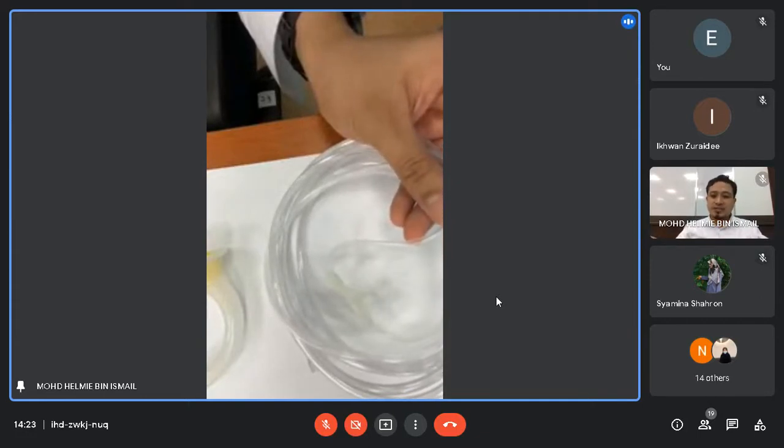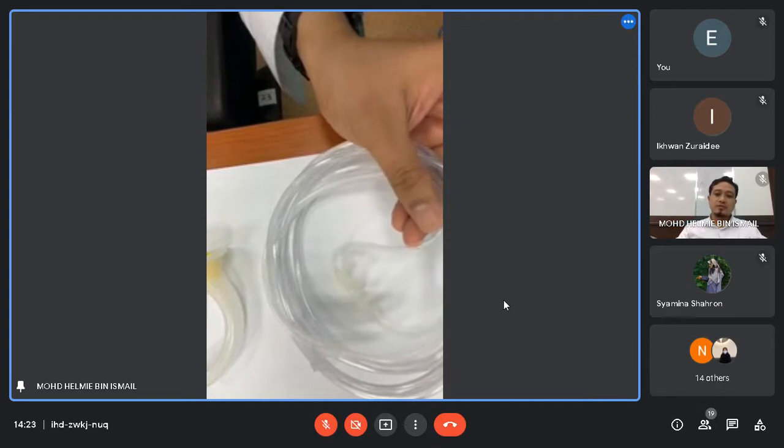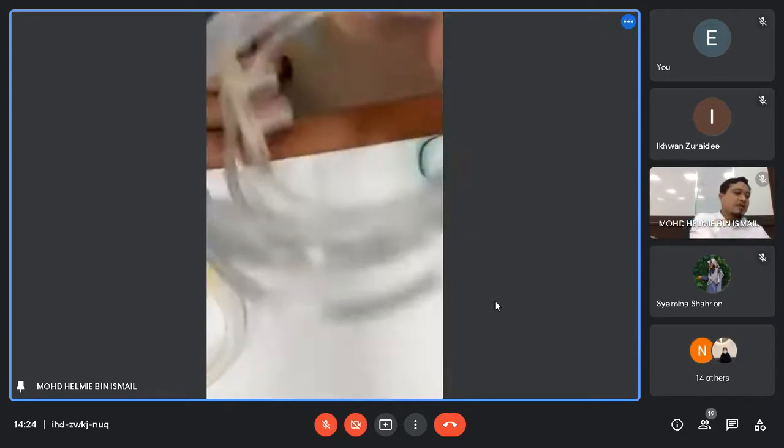So in spite of increasing the FiO2, you give complications to the patient, such as ulcer, mucosa dryness, patient discomfort. So if you give more than 6, you don't increase the concentration of oxygen much, even though you give the complication to the patient.